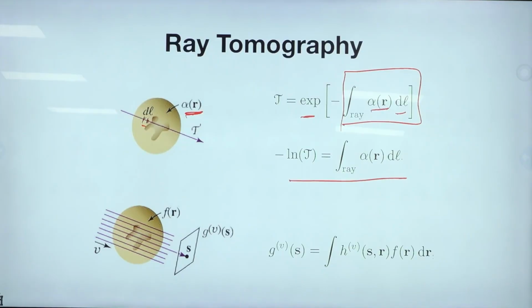And if you take the log, because you have an exponent here, you take the natural log on both sides, and you can get this kind of an equation. This is the relation. This is what happens in the instrument.